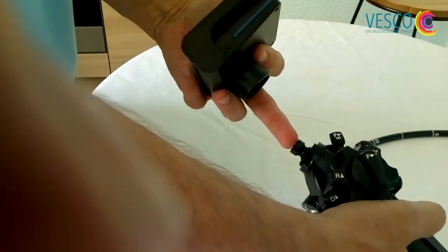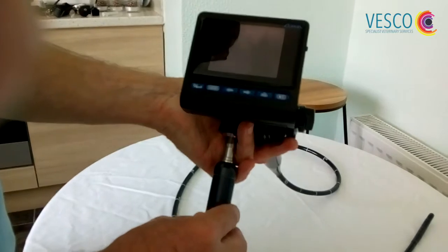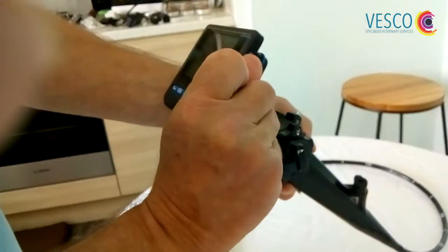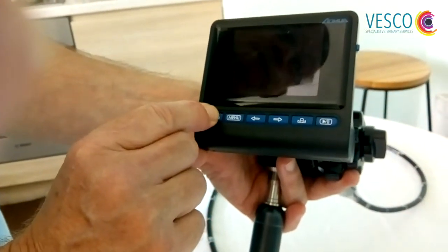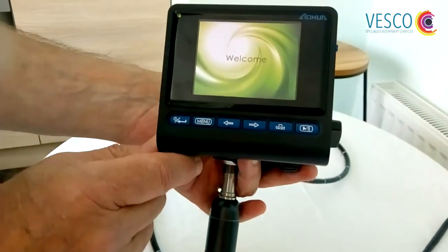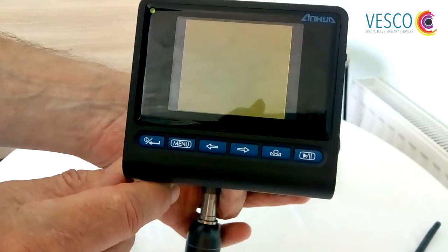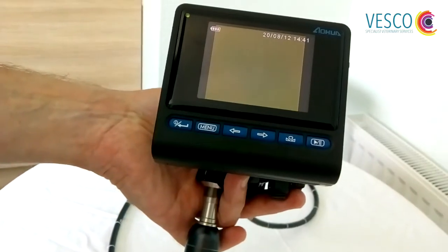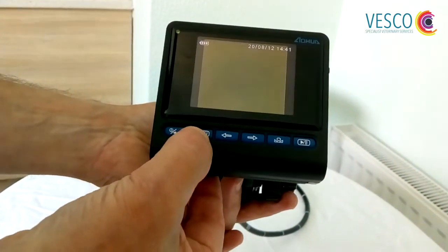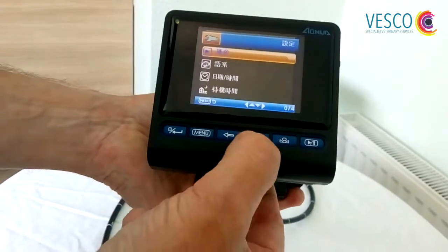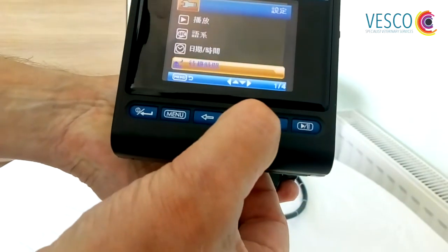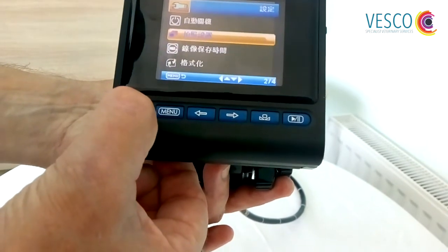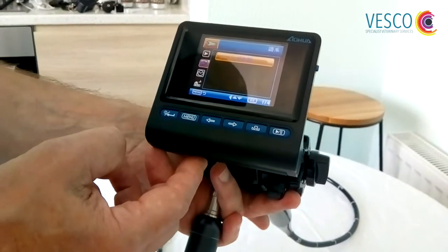Once we have the viewing screen attached, first turn on at the side to the on position, and then press the power button on the front. You can see you get a very nice welcome screen and it will go to a live screen. What I want to go through first of all is to make sure that it is set up in the correct language. To do that, press menu and then scroll down using these keys here.